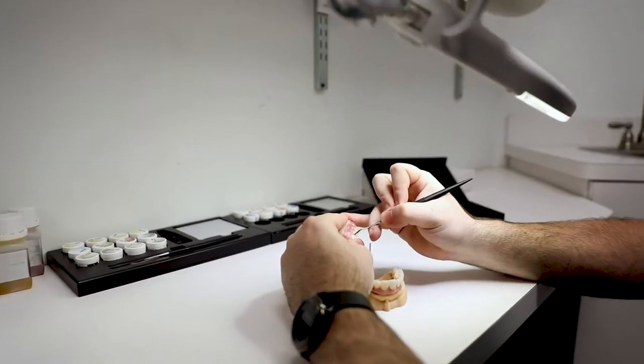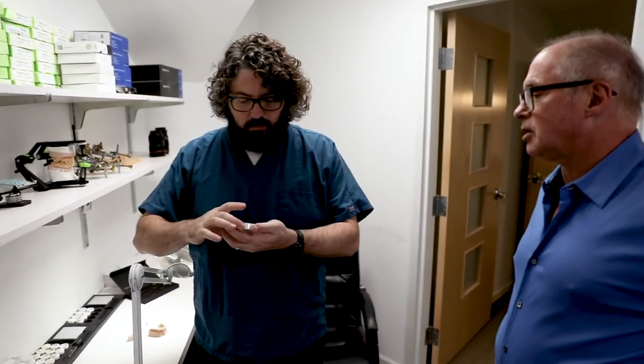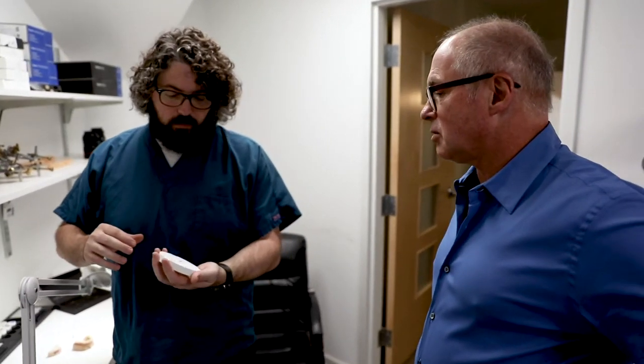We can actually get a natural smile library. We have people come in whose smiles we love, and we scan them digitally. The Zirkonzahn people also gave us a smile library - just natural smiles of people's beautiful teeth, not lab teeth. So we can show our patients this library and ask if they like any of these.